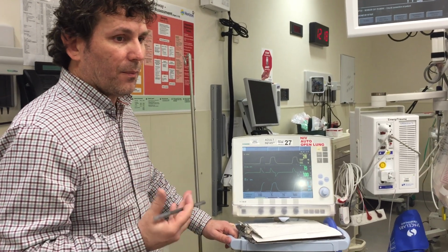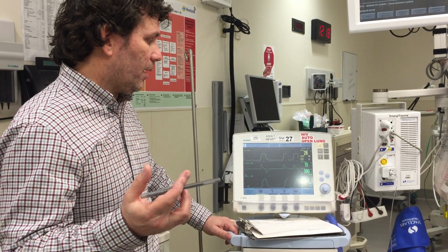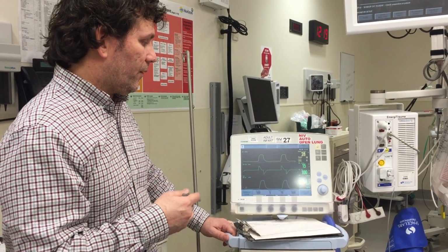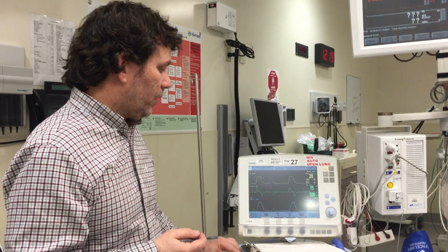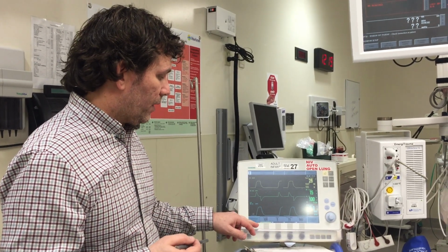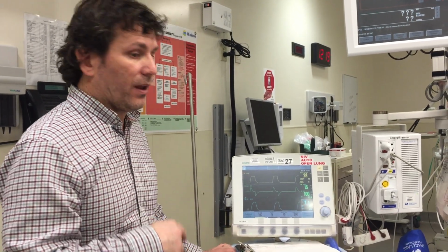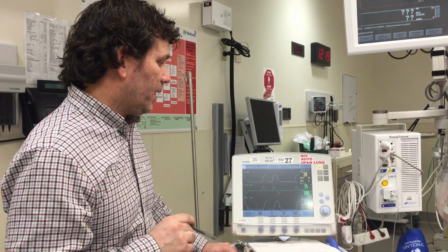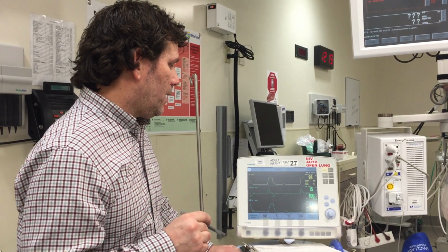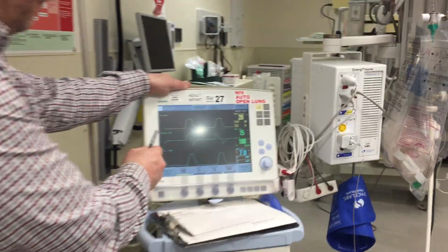Of course, we're going to have some permissive hypercapnia as well. You can treat your hypercapnia with your tidal volume and your respiratory rate, i.e. minute ventilation. And your oxygen will be treated with FiO2 and PEEP. Okay, those are your main parameters. It does get a little more convoluted than that, but for the purposes of this, this is all we really need to focus on.